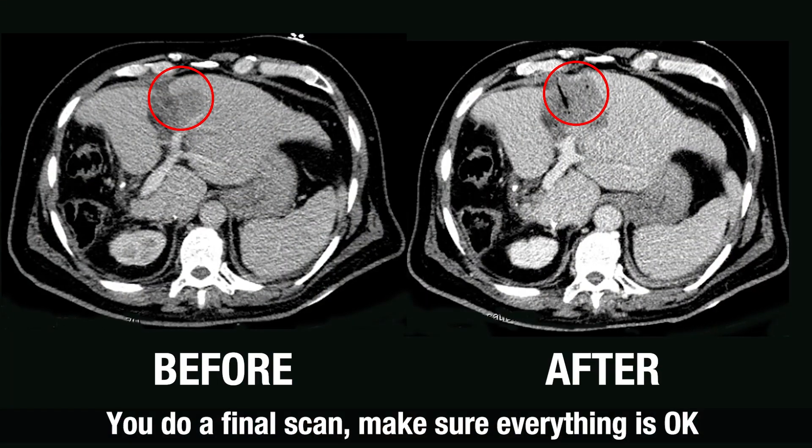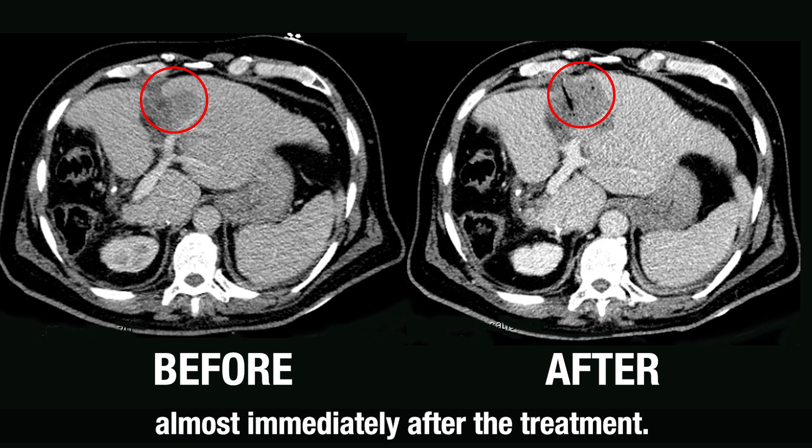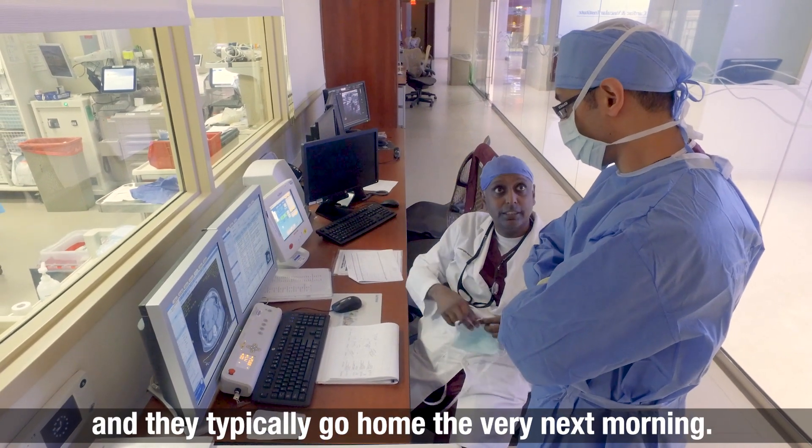You do a final scan to make sure everything is okay. You'll be able to see the difference almost immediately after the treatment. Most of the time patients are in-house for just one night for observation, and they typically go home the very next morning.